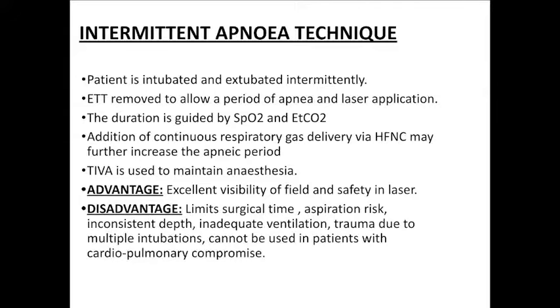Two types of ventilation techniques are used. One is the intubating technique and the other is the non-intubating technique. The non-intubating technique has already been explained. When it comes to the types, one is the intermittent apnea technique.